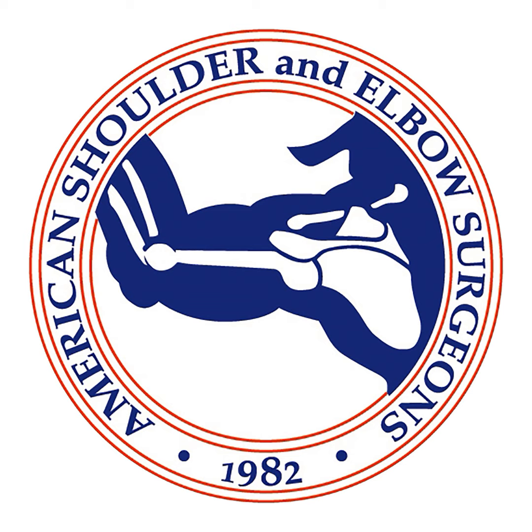If you take your time, most of these implants are designed to be explantable. So they allow for a thin osteotome and curette or something like that to free up some of that bone porous metal interface. So if you take your time, you can take it out without removing much bone. And if you're impatient like me and you just kind of bang it out, you still end up with a situation where it's not difficult to put in a short stem humeral implant as the revision.